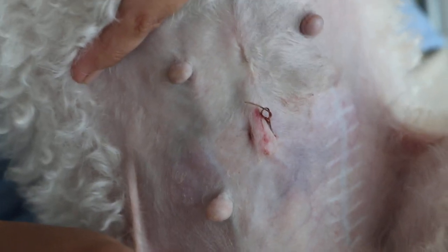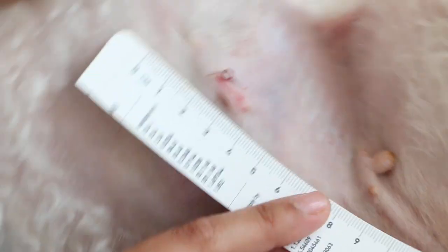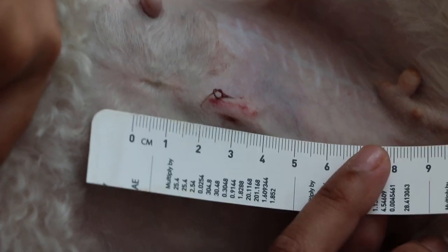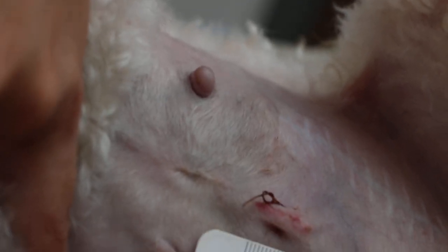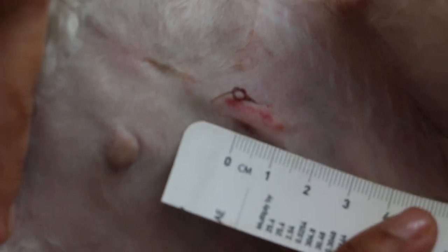From the umbilical scar — the umbilical scar is here — you measure about two centimeters. Two centimeters from the umbilical scar, and for a poodle you make the first incision there. This is the midline incision, and you cut about 1.5 centimeters.